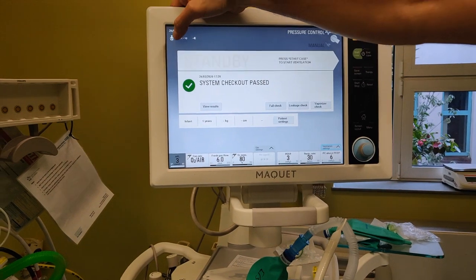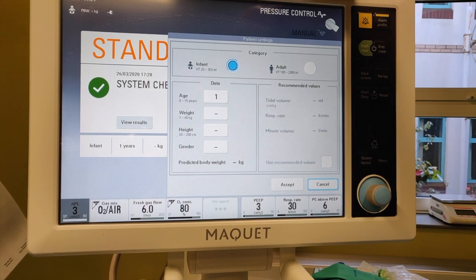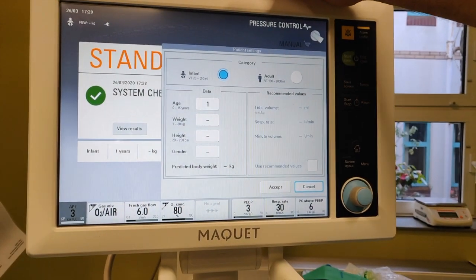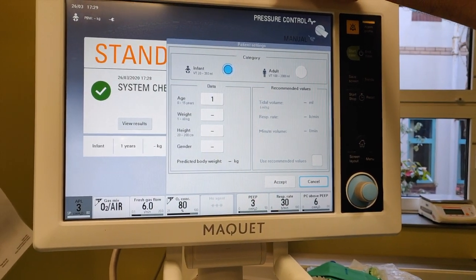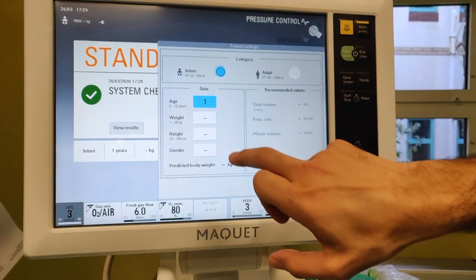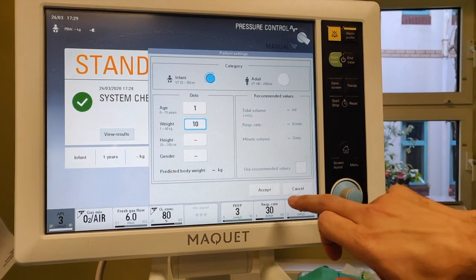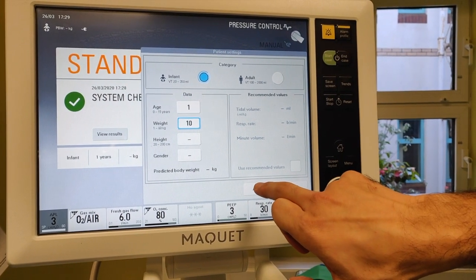In here you can put in the weight of your child or adult. We're going to try on RPLC to use these on the bigger kids, so 10 kilo plus in the first instance. We'll set you up for 10 kilos to make the maths nice and easy, and press accept.